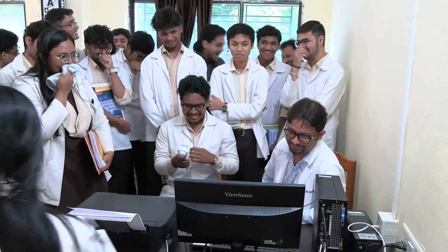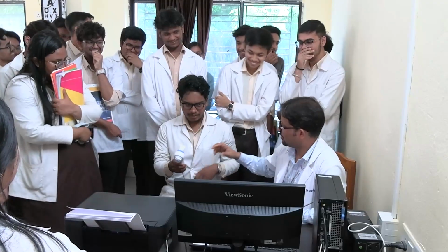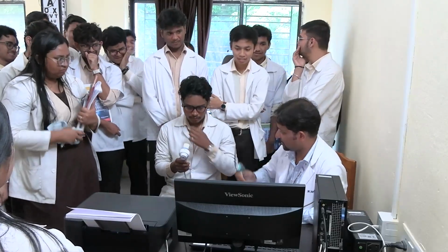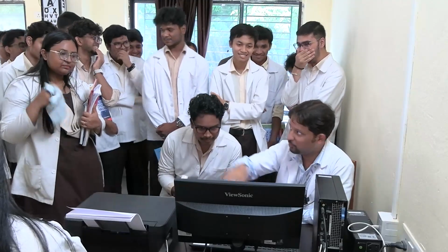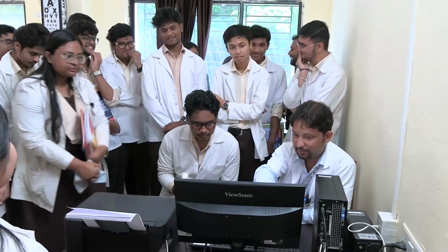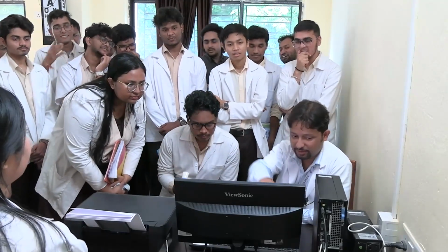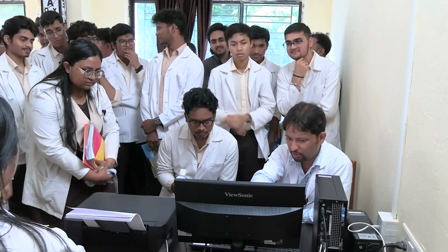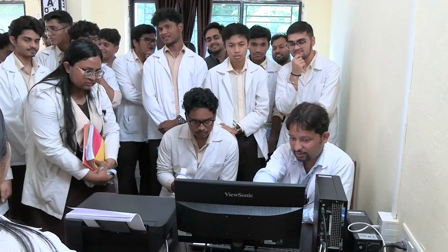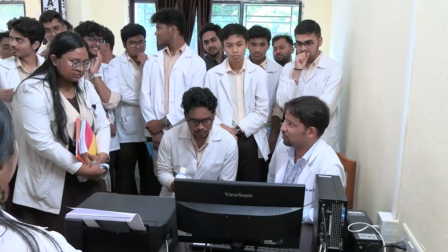Not good. There is a lot of air leaking from the sides, right? So this graph that you see here, the shaded part you can see on the screen, this is where the predicted range should lie, right? So it is grossly less, and the morphology of the curve is also not proper.